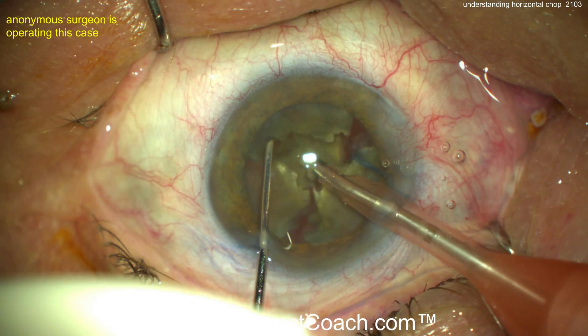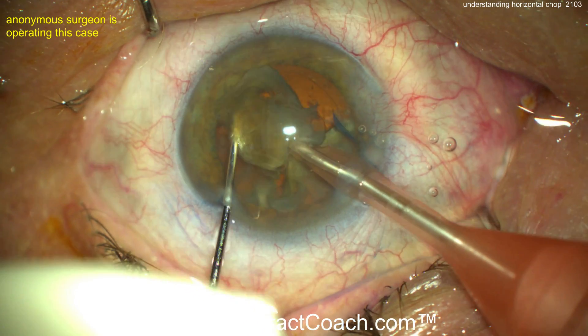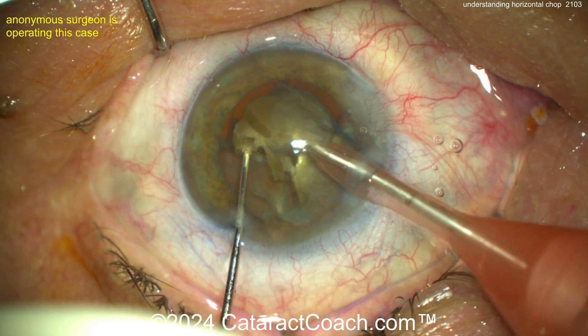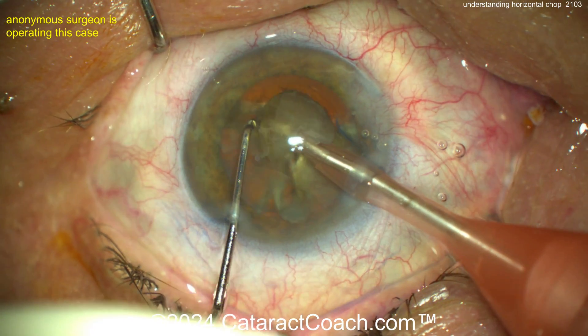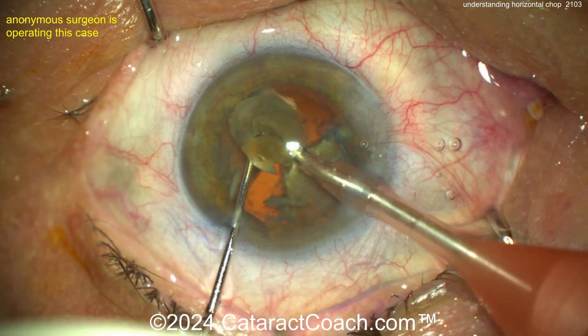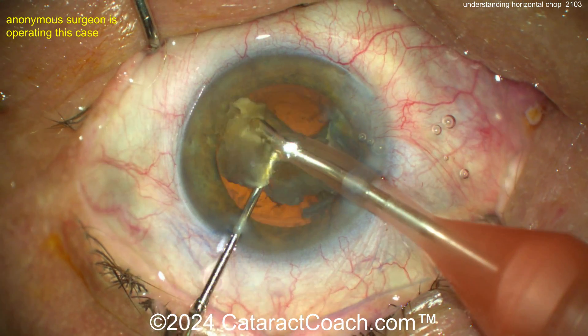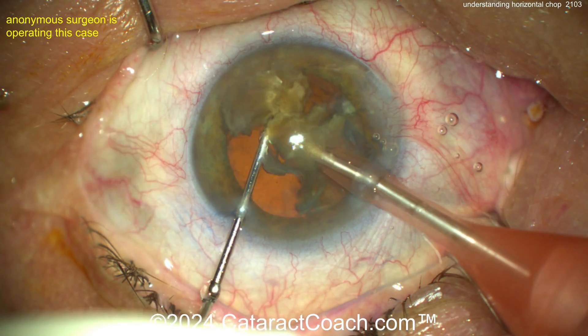This is a horizontal chop, and you can use a ball tip chopper. This chopper has a bulbous tip, and some people like that because they think it's safer near the capsular bag — less risk of damaging it. That's perfectly fine. But you can do this with even the traditional Nagahara-type choppers; you don't need a ball tip chopper. In fact, I don't recommend one and don't really use one.